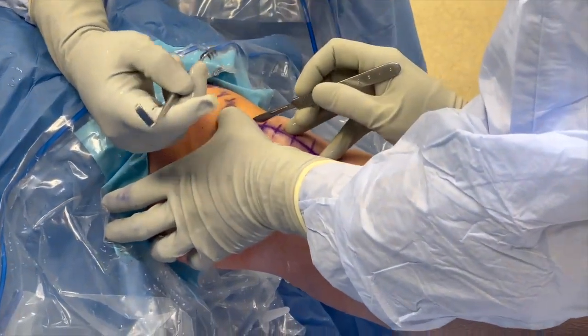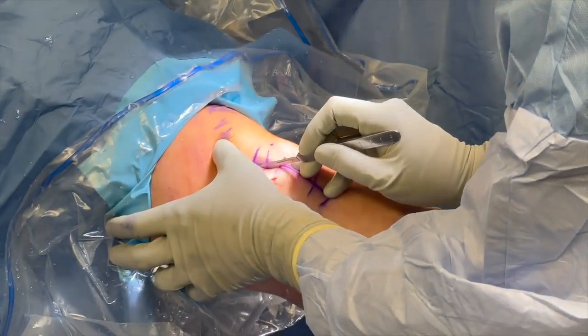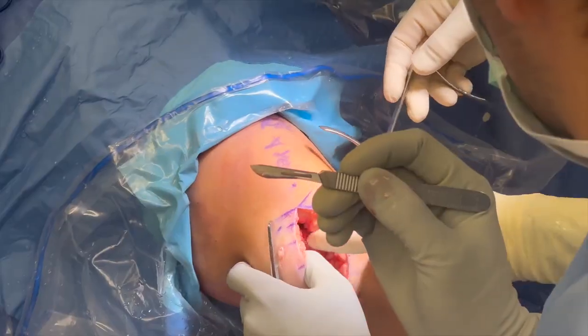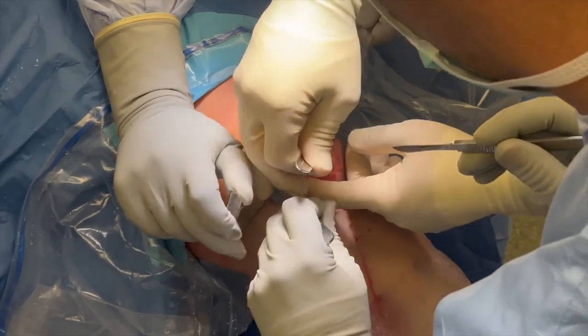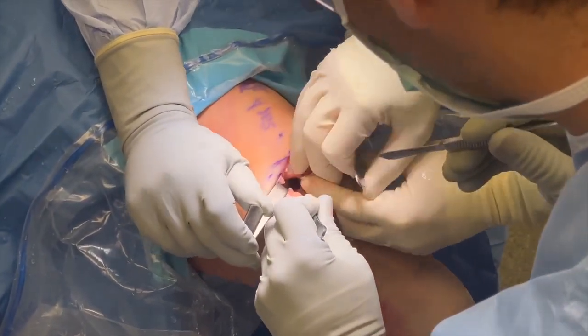Next, a medial peripatellar mini-arthrotomy is performed. This approach allows for better visualization of the anterior horn of the medial meniscus. Dissection is then carried down through the superficial and deep tissues until the medial compartment is accessed. Z-retractors are placed and a 70-degree arthroscope is used for visualization.